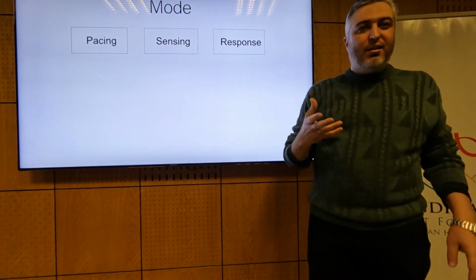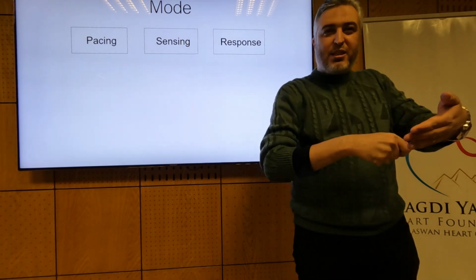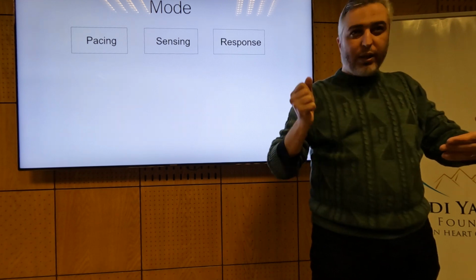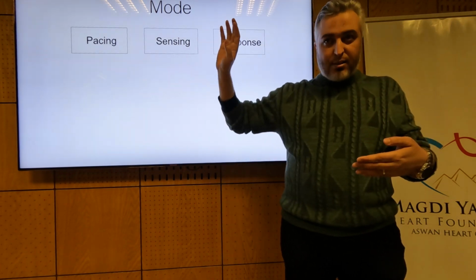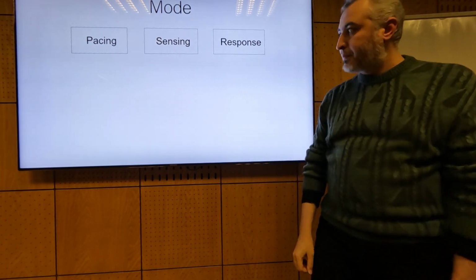There's no way, if the heart has a rate of 80, that we put a pacemaker at a rate of 60 and get the heart slower. You cannot do that. Why can't we do that? Because the faster will take the upper hand. Since the heart is faster, the rest of the cells will be excited.